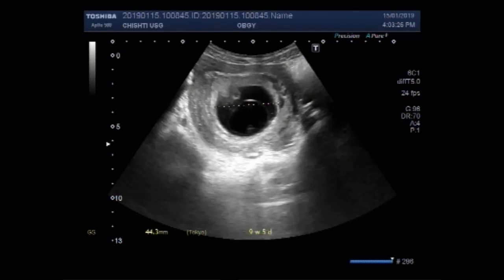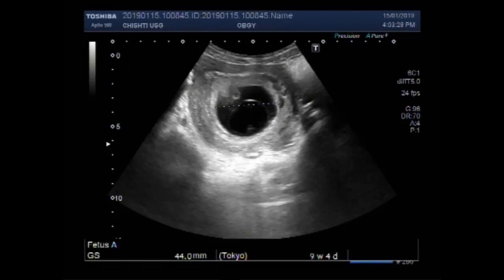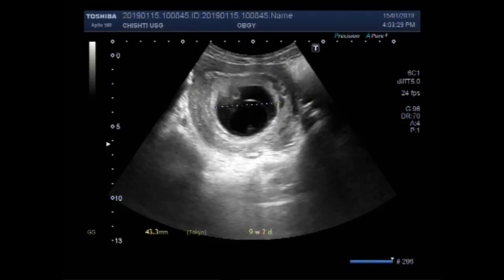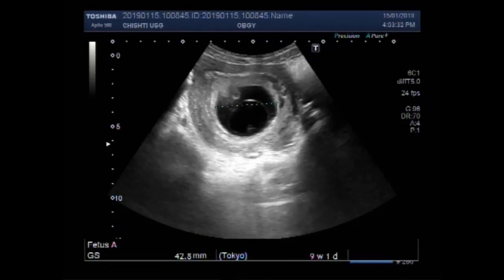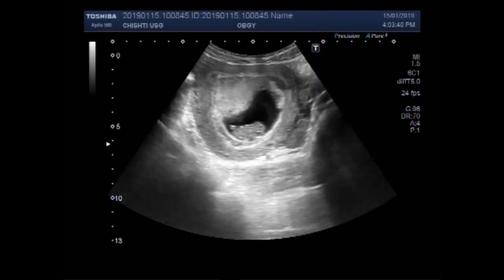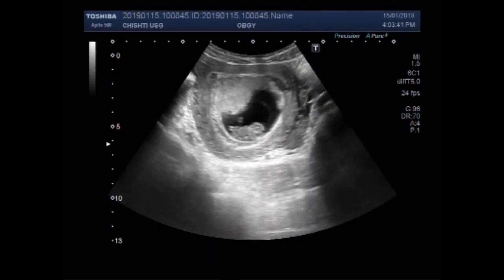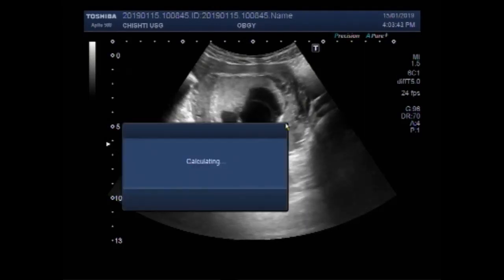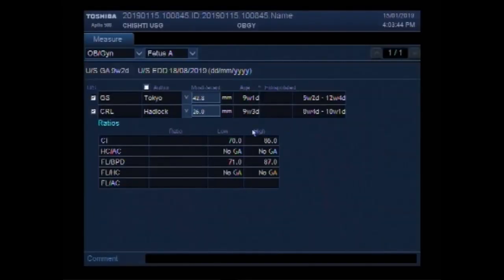By measuring the gestational age of the fetus, by measuring the gestational sac, it is about 9 weeks and 1 day.